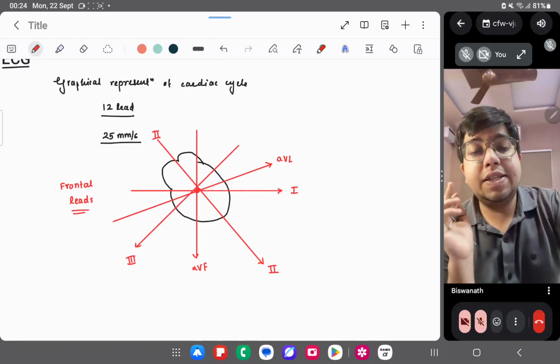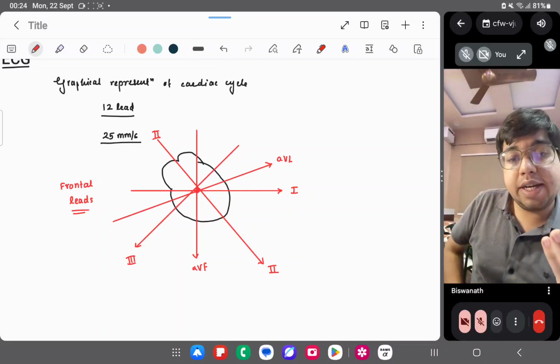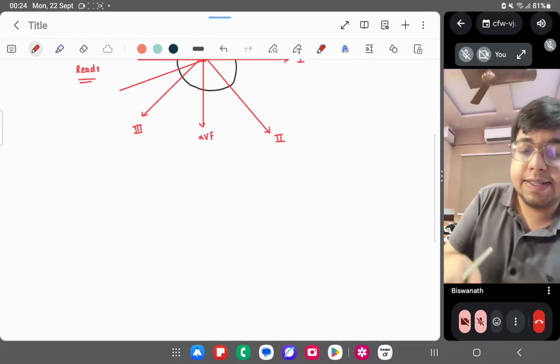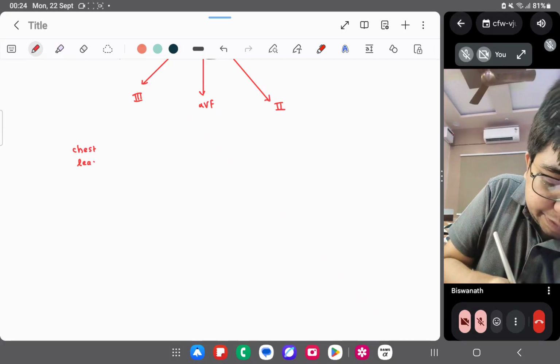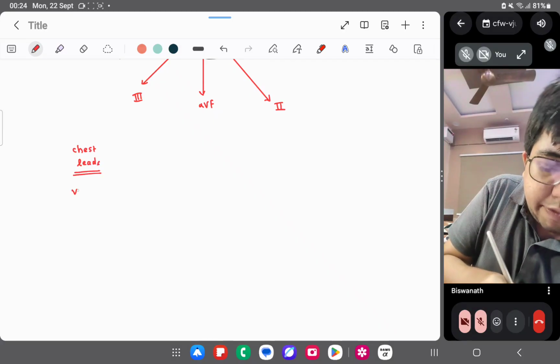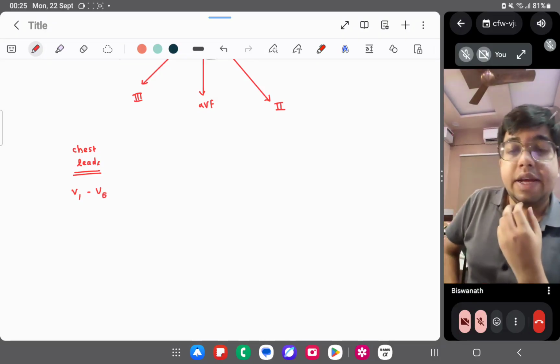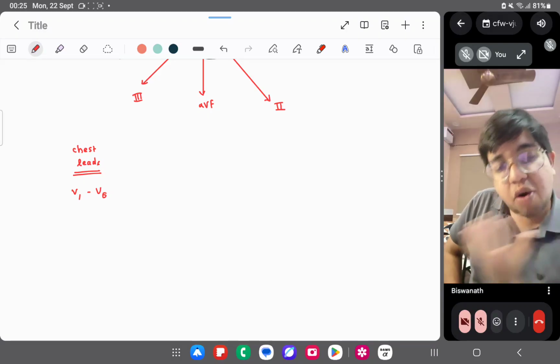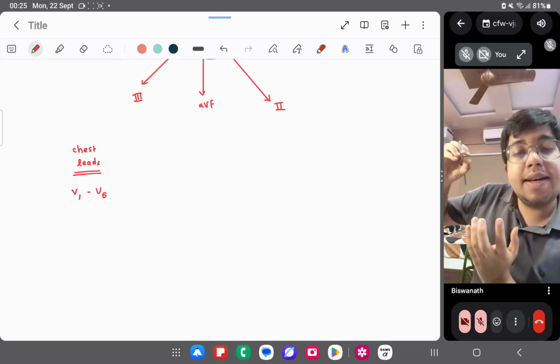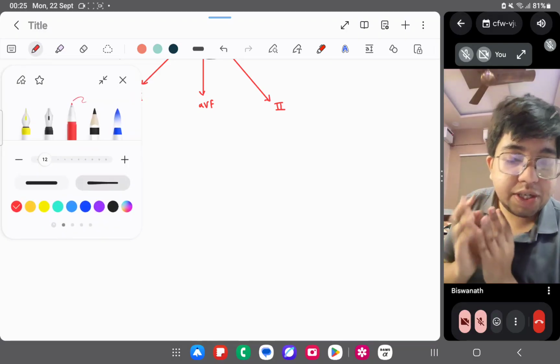If the frontal leads are clear, we'll move ahead and discuss the horizontal leads, or the chest leads, or the precordial leads, numbered from V1 to V6. Now, I can't really show you that placement, but what I can do is place the heart in that horizontal plane and place the cameras along with it. Don't use your brain too much, just try to understand.